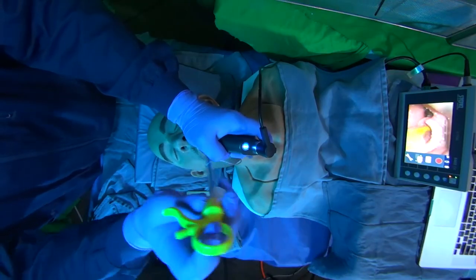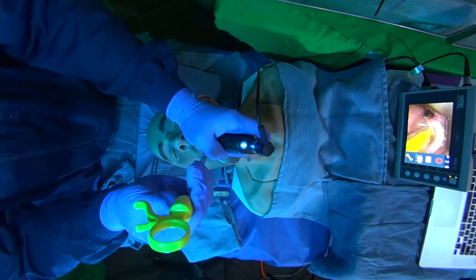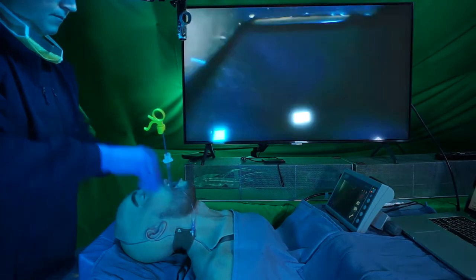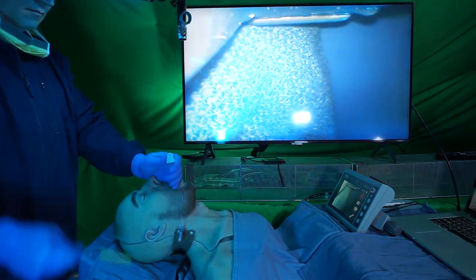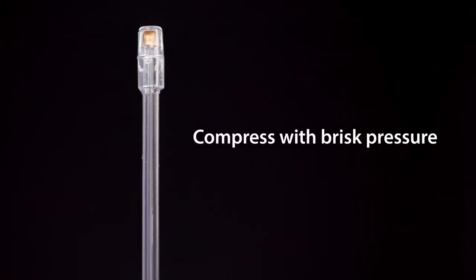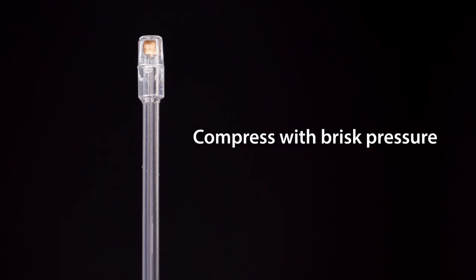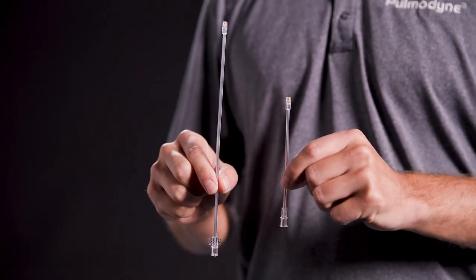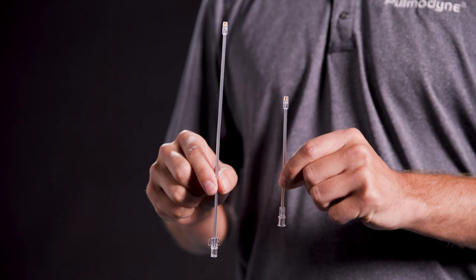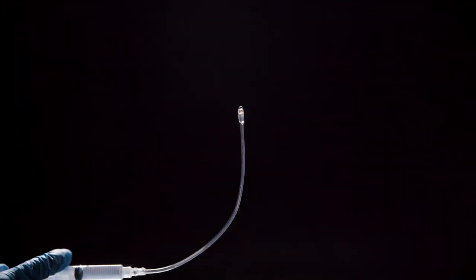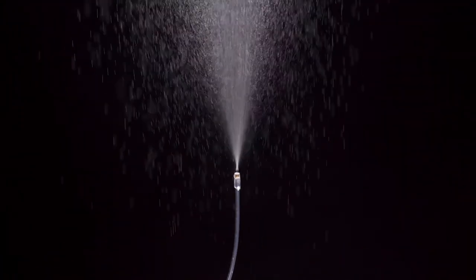Intubate the patient. For best results, compress the syringe with brisk pressure to maximize atomization. The DART Reach is available in multiple sizes to suit a wide variety of treatments.